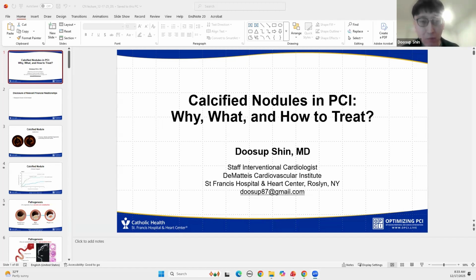We do atherectomy to debulk the reprotruded part, or, if the stent was underexpanded, we do stent ablation to get rid of those parts. But again, IVL, laser, atherectomy, you can use multiple different lesion preps, but for now I don't think there's any proven effective treatment option in that kind of situation.